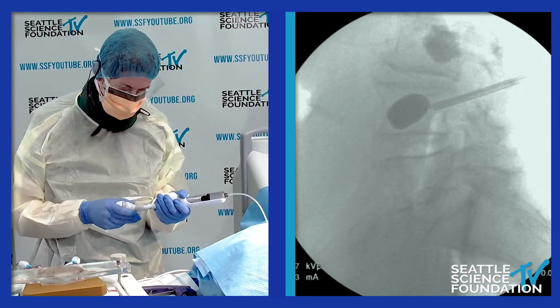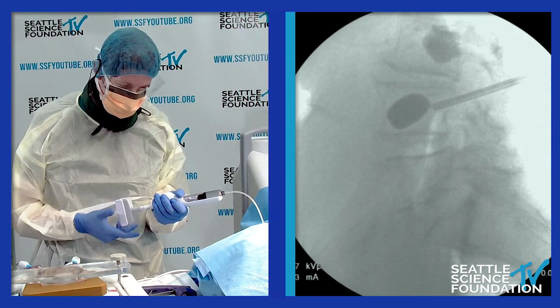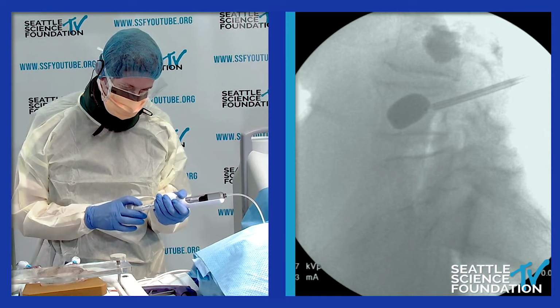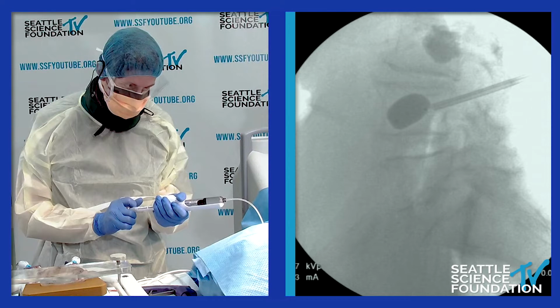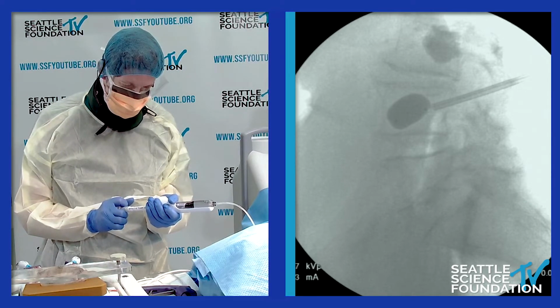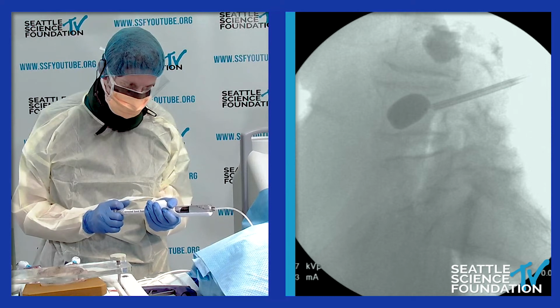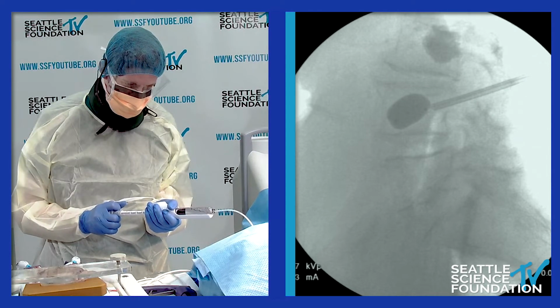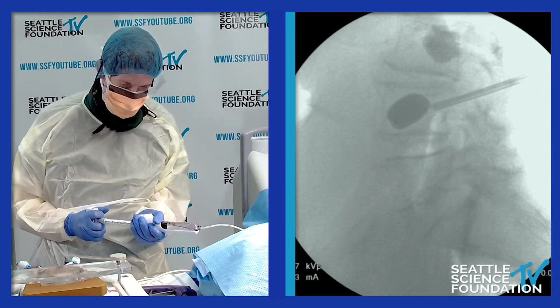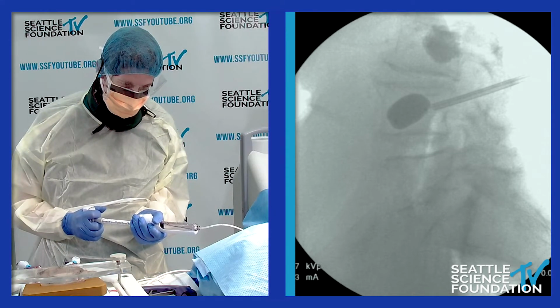So what is the role of balloon kyphoplasty in some of those cases? Well, you're not able to inflate a balloon of this size. Maybe a smaller balloon is an alternative, okay? Or using some of the tools that we talked about, like a curved needle, to get across and provide the cement across and within a smaller area.